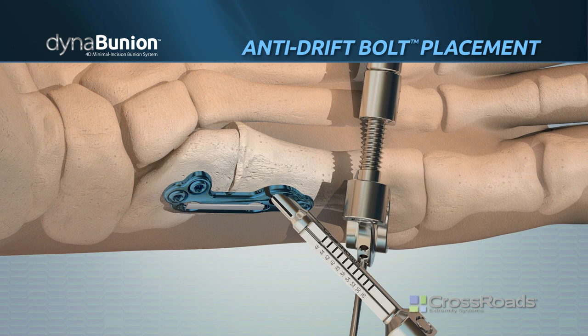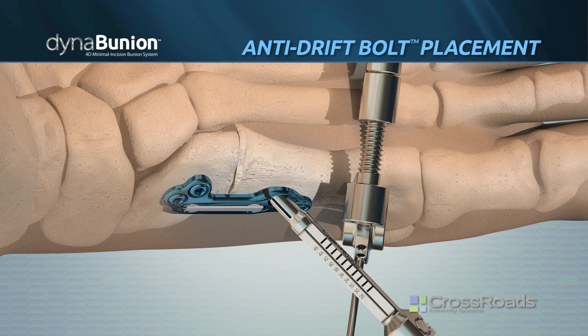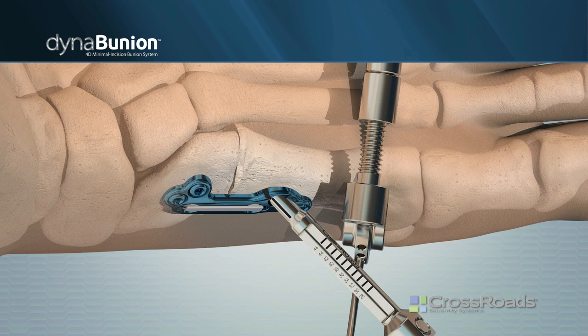Under fluoroscopy, place the anti-drift bolt depth wire through the guide until the tip of the wire is in the base of the second metatarsal. If a more distal trajectory is desired, the handle can be rocked proximally to aim the guide more distally.